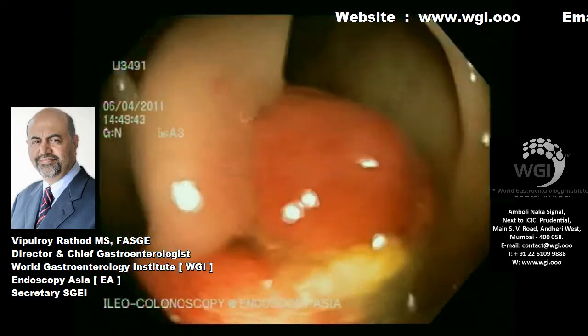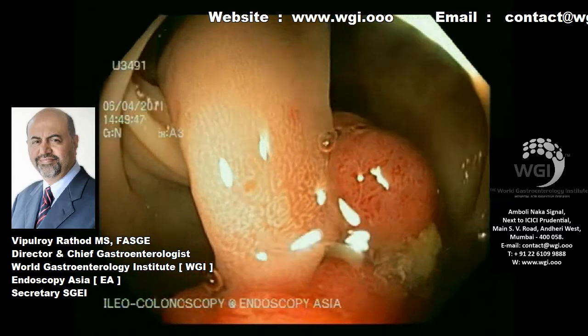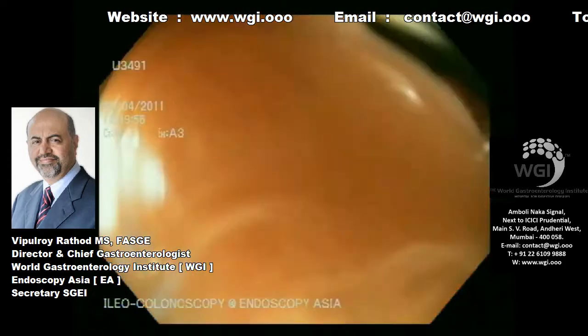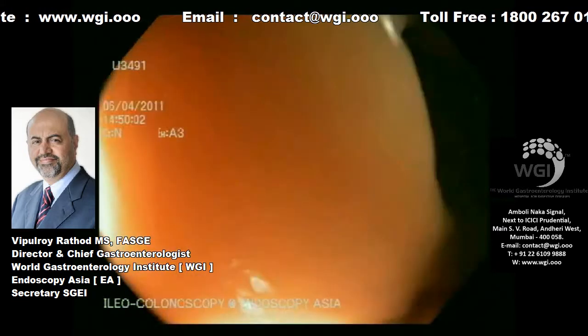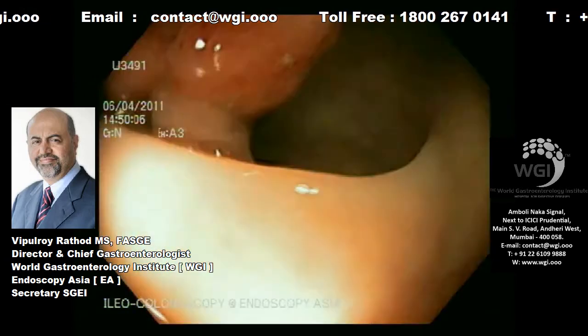Now we are coming to the exact site of the polyp. This is a long-stalk polyp — you can see the head is multi-lobed. I am not getting a good position, so I have rotated my scope with a clockwise torque.